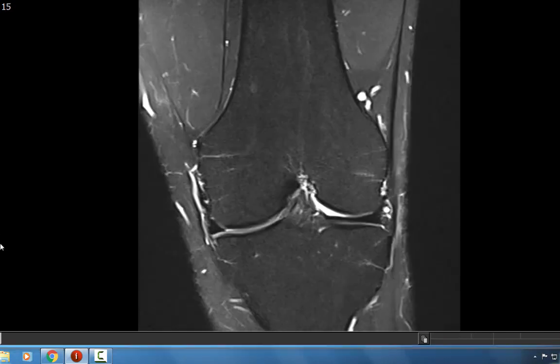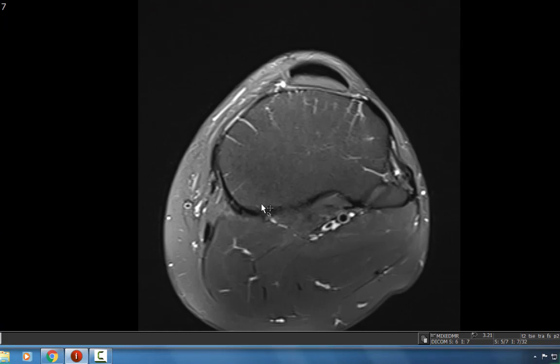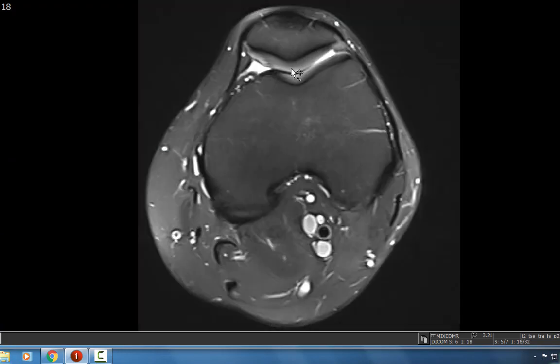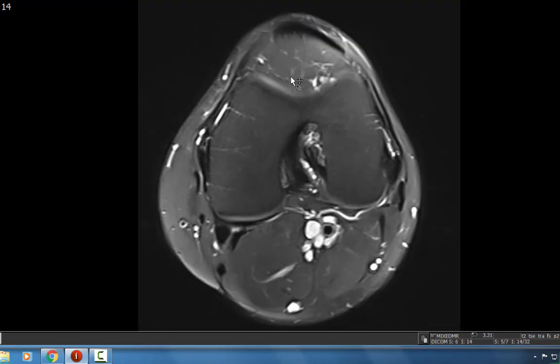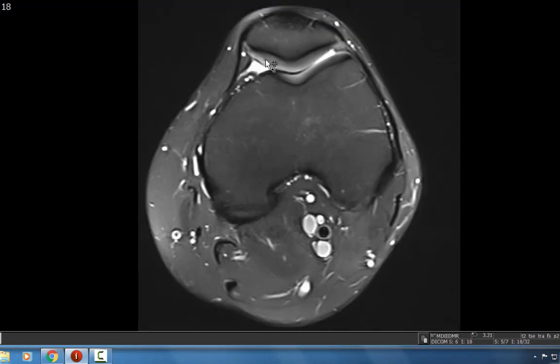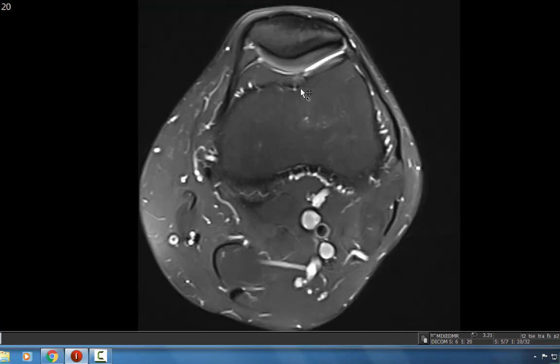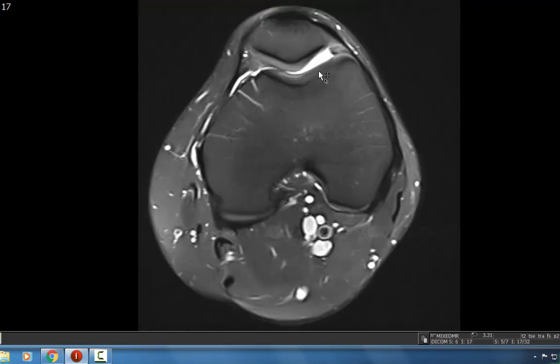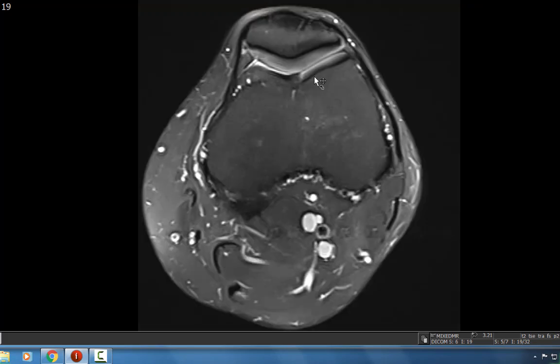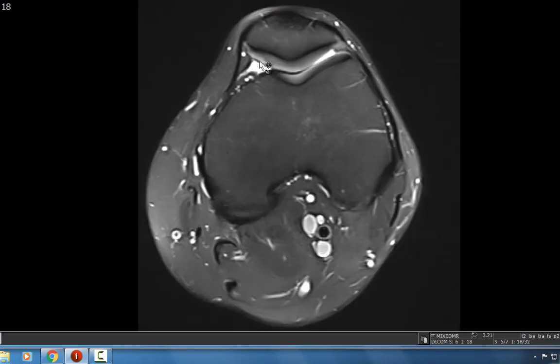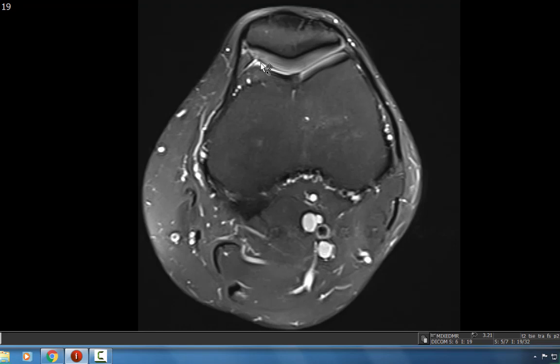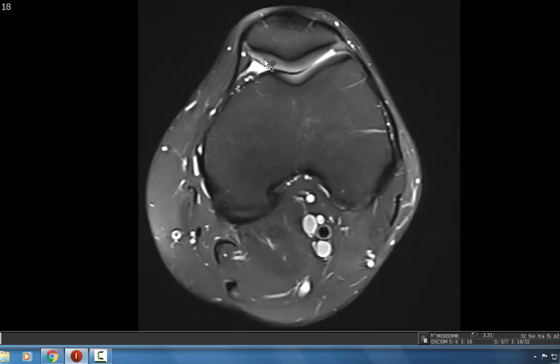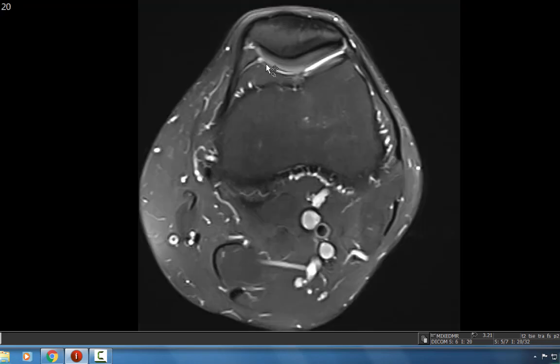To look at the patellofemoral compartment, it's best to look at the axial images because you can see the patella, the median ridge of the patella, the medial patellar facet articular cartilage, the lateral patellar facet articular cartilage, the medial trochlea, and the lateral trochlea. Notice that it's nice and gray intermediate signal without any focal chondral defects. There may be minimal partial thickness chondral defect along the medial patellar facet articular cartilage, as we're seeing T2 hyper-intense signal involving maybe 20% of the thickness of the articular cartilage.